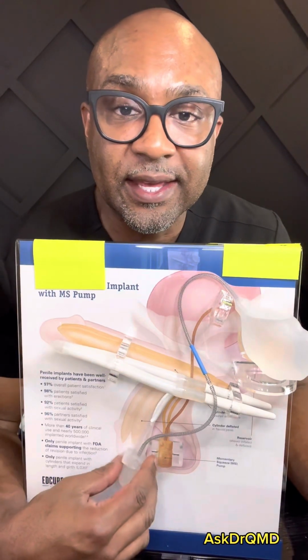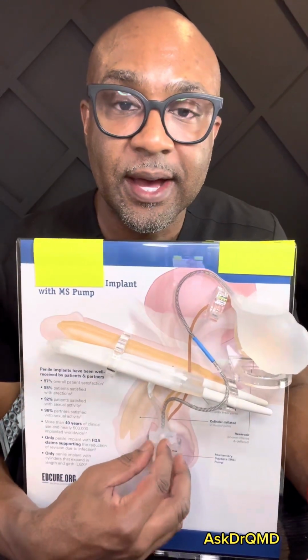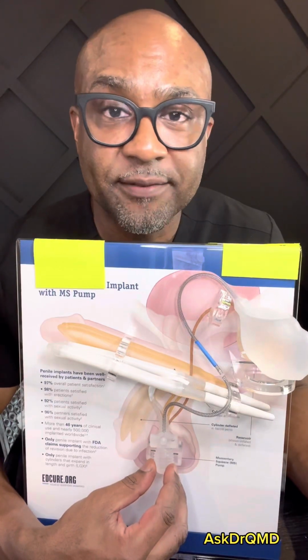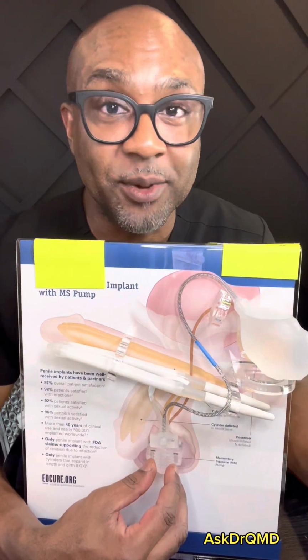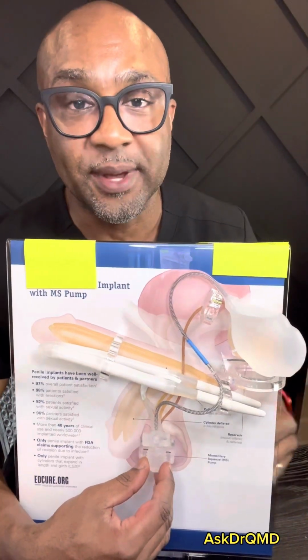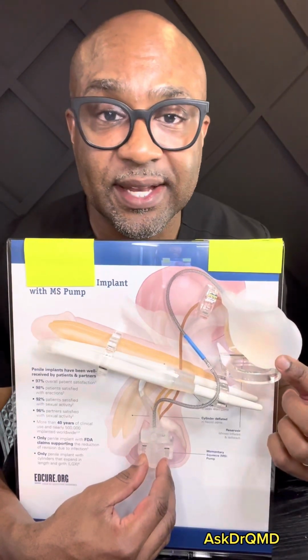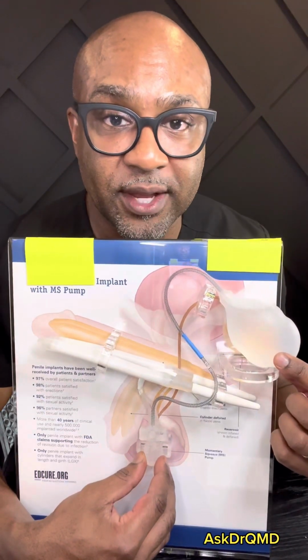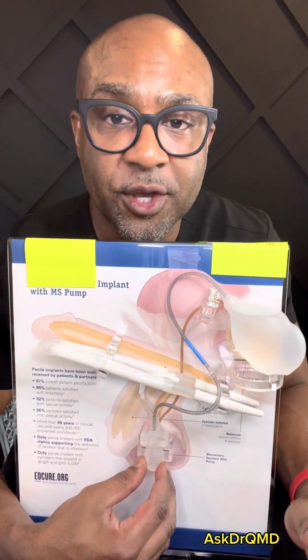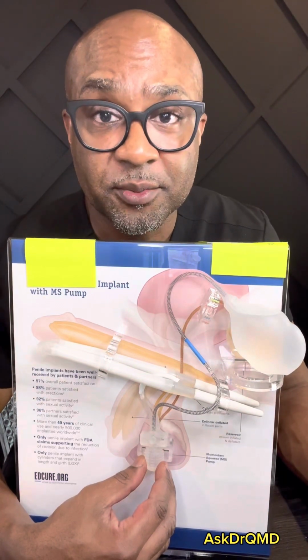It is either an outpatient procedure or overnight stay. You can actually use it 6 weeks after implantation. People ask, why do I have to wait 6 weeks to use this? The reason is that your body will form a capsule around the reservoir, and you want this to be done in its full state so that water can always transfer back into the reservoir without issues. Some people also ask, what are the risk factors with this procedure?